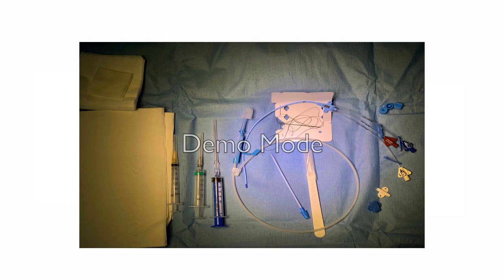You will have a guide wire, you will have your catheter, scalpel, a dilator, suture size 3.0 silk with a straight needle. You will have the blue caps, as well as the butterfly clip or fixator.